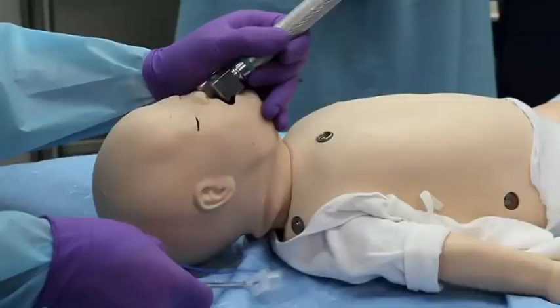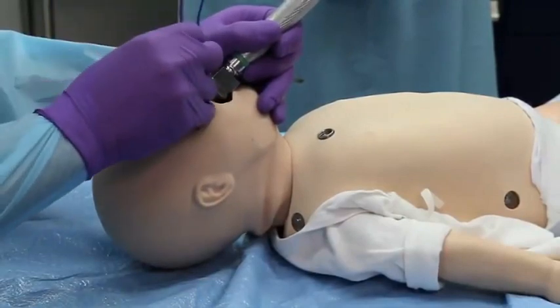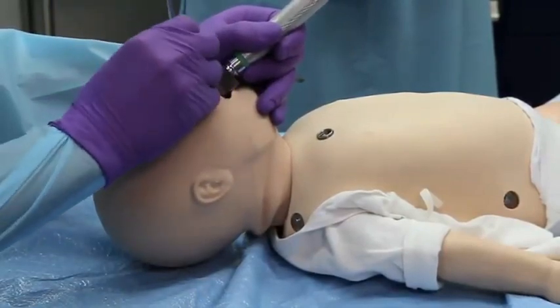Look at the epiglottis and then the vocal cords. Insert the endotracheal tube not more than 2 centimeters past the cords.